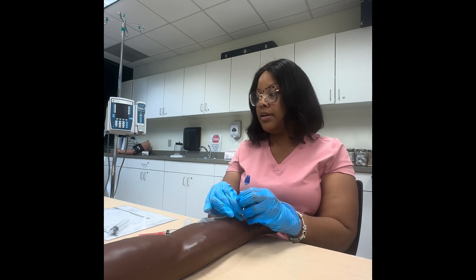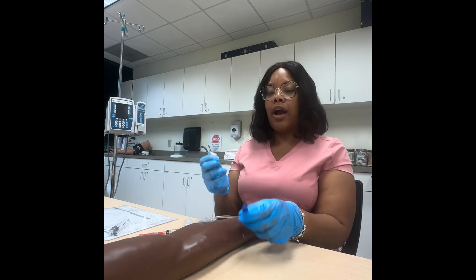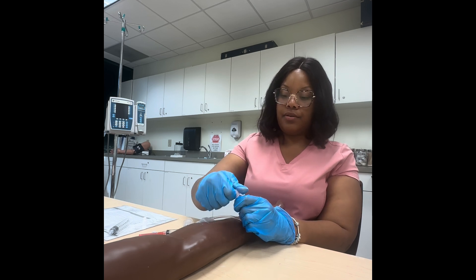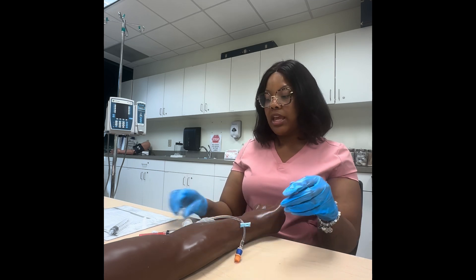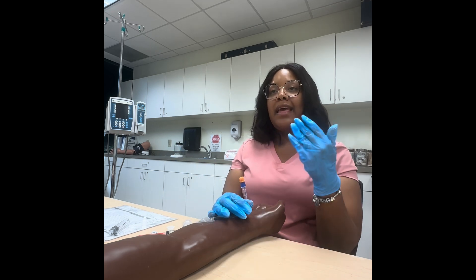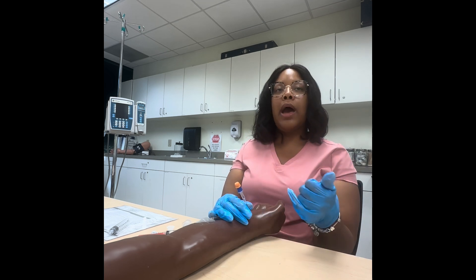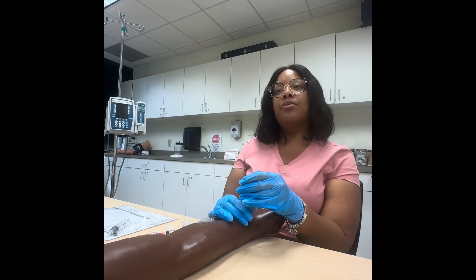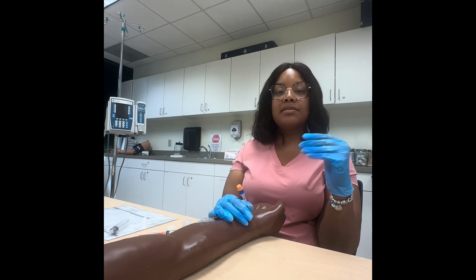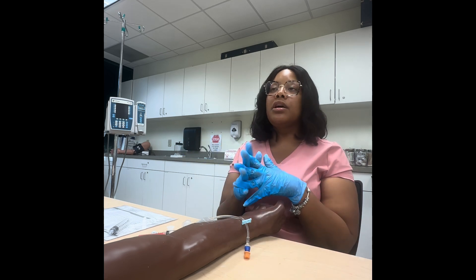Now that the flush is done, clamp the IV and add an alcohol swab cap to keep the IV clean. This cap is single-use only — once you remove it, get a new one. Earlier this IV didn't have a cap, which is why we had to scrub the hub. Even if a cap is on there, I always teach to still alcohol wipe it, because you don't know if it's a new cap — if someone is reusing it, the antibacterial mechanism won't be effective.